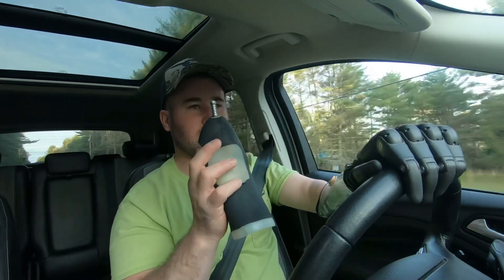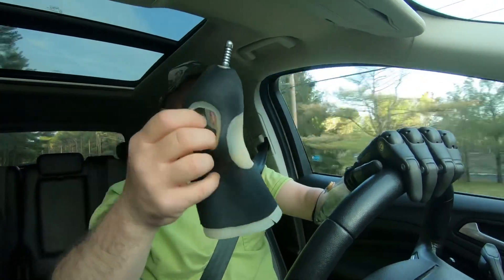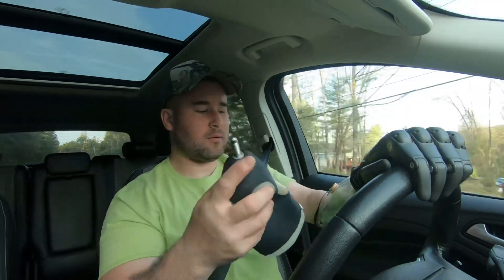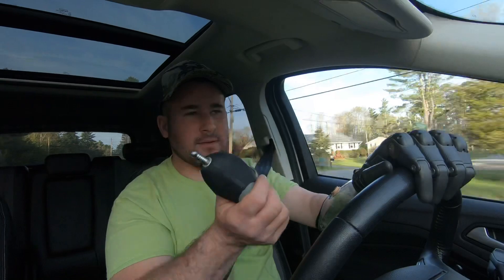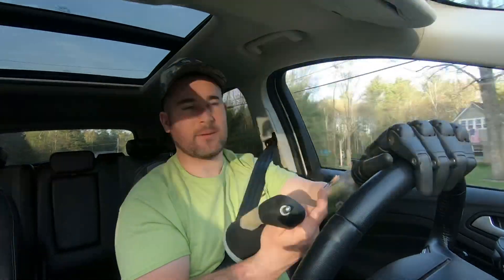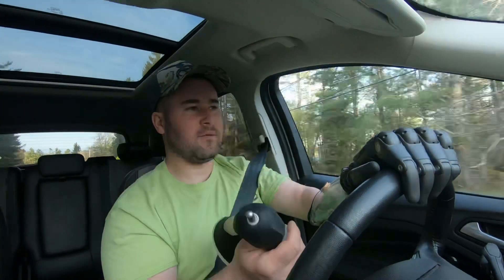The bigger issue is I also wear the other type of socket system, which is liner-suspended. This rolls over your arm — your skin — like a sock on your foot. And then this pin goes down into the arm, and this holds it on. You're not going to lose suction with this. You could basically pull this apart before it's going to slide off of you. It's a very good system.